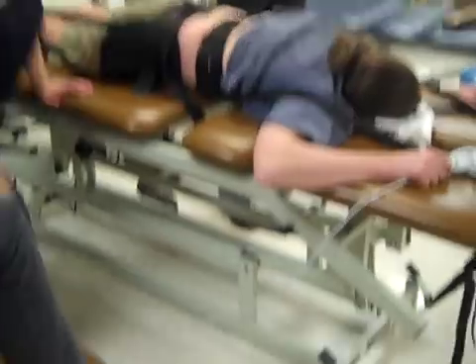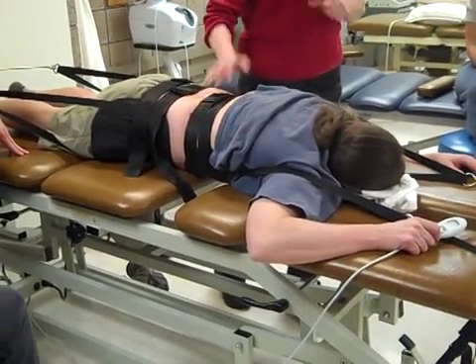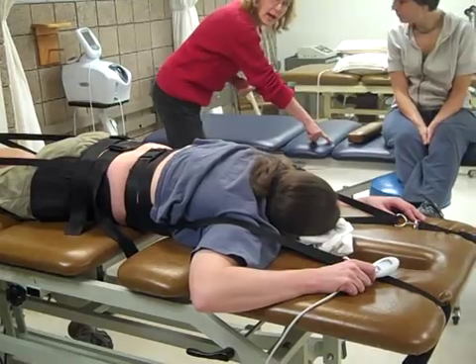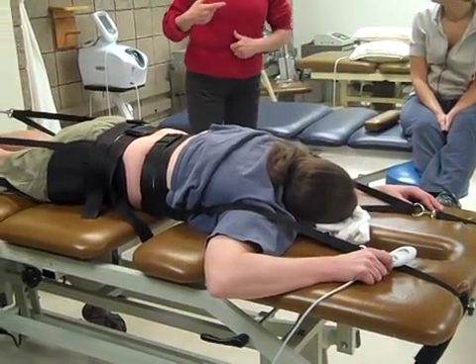Okay, so make sure these belts are tight, super tight. If you hook these belts to the table, make sure those belts are overlapping that spot. That gives them somewhere to go to lie down.